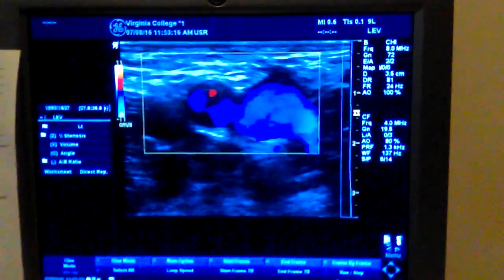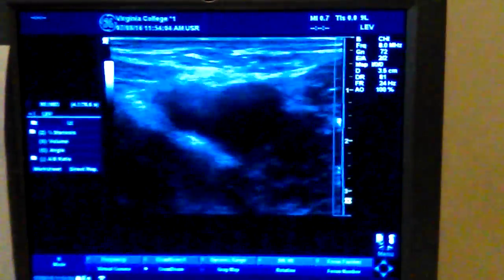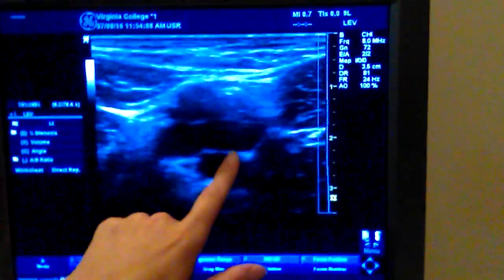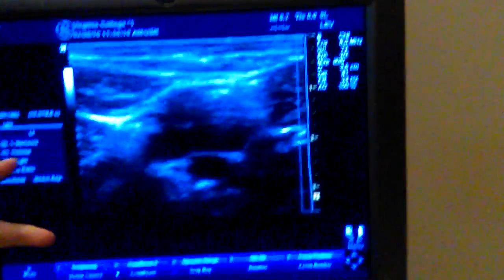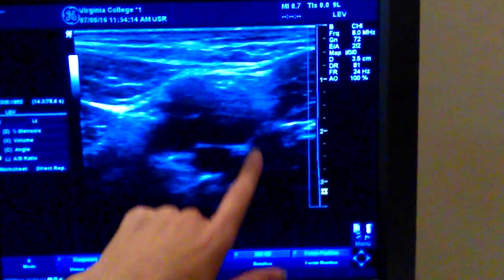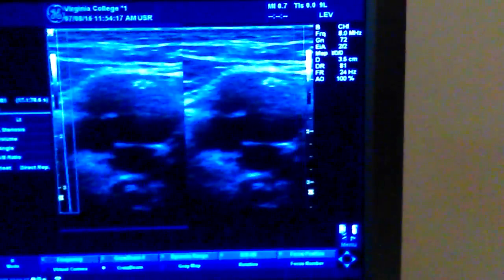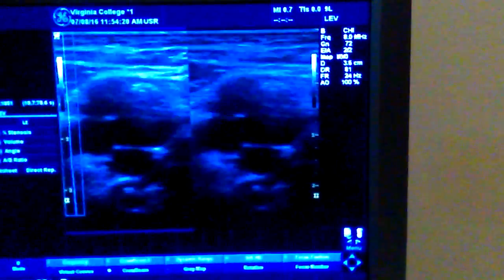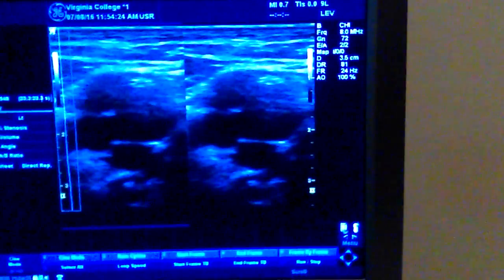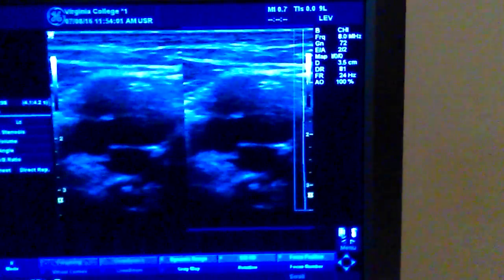And then from there, we just want to come down, and we're compressing as we're coming down, making sure that the vein closes all the way. And then this is our next image. We'll see the two arteries where they have bifurcated. This is SFA, PFA, and here's our CFV still. So we'd want to compress, and well, we do it on dual screen. All right, and then you can hit set, you can freeze, and then hit set to make the other side active, well, the R to make the other side active.